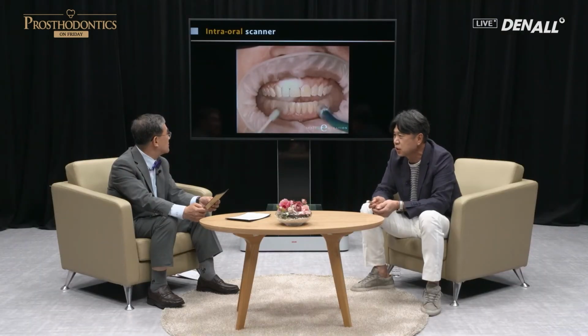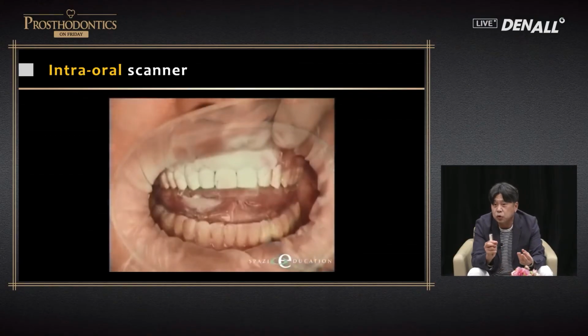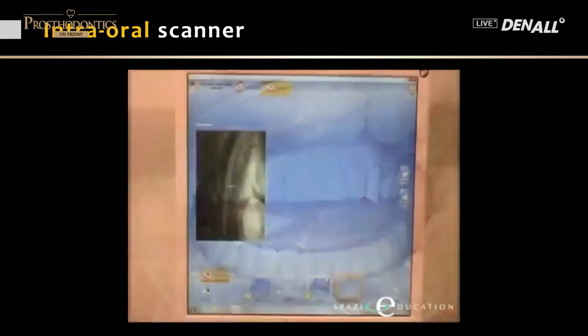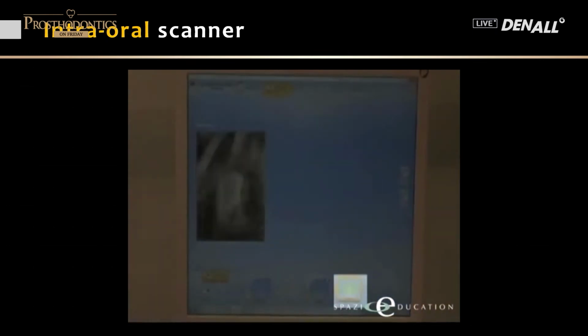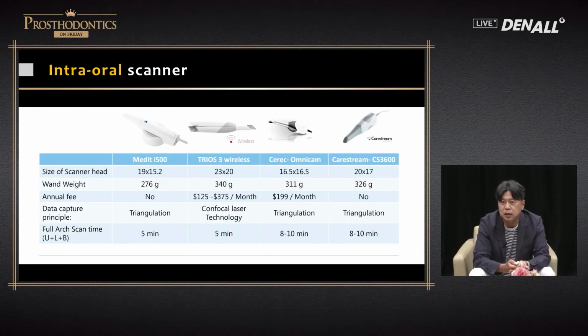So this is the spraying in the video. It shows scanning being performed after spraying powder on the teeth. It adds thickness, therefore it may not be good. This is a picture from the internet. In general, the size and the annual fee need to be considered, though that's not relevant to Korea.